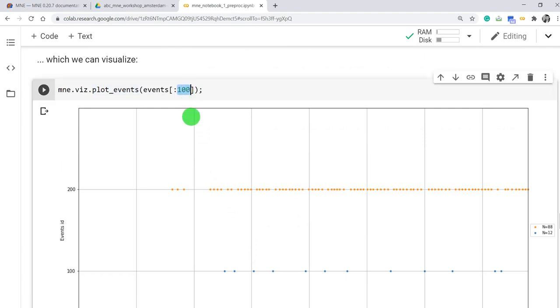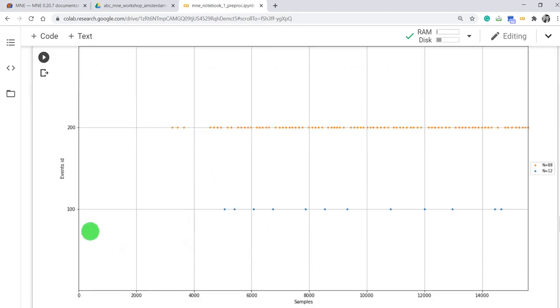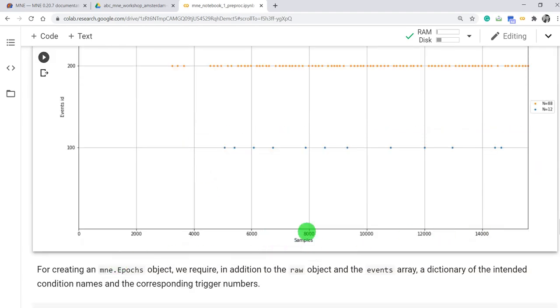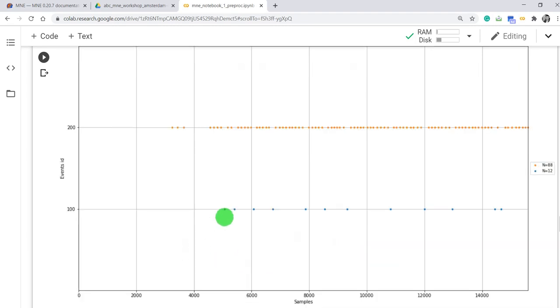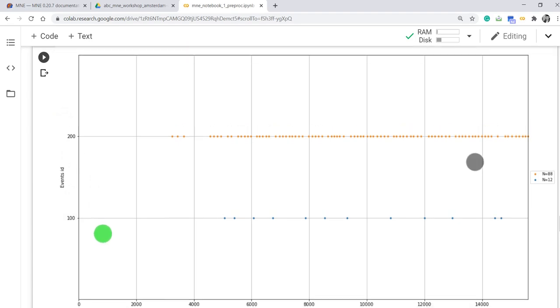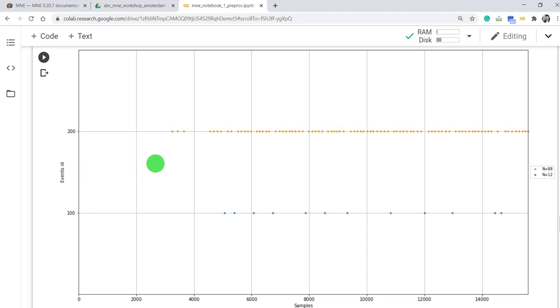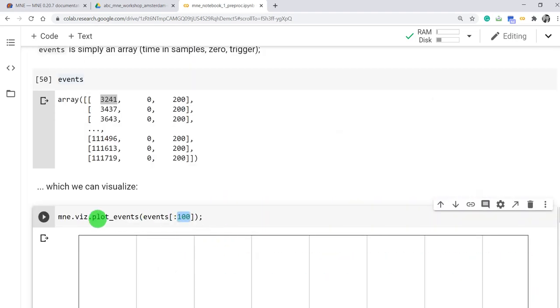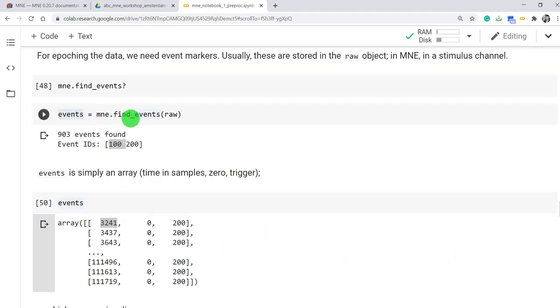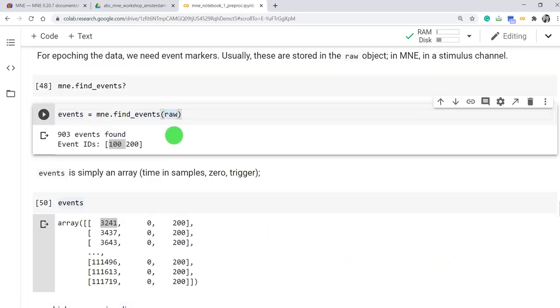We can visualize those events, the first 100 events. So here we have time axis of EEG samples and the location of time markers or events. 100, 200, those are event IDs. So now can you guess which one could be related to target ERP and non-target ERP? I said that the data loaded is ERP, event related potential. So as you can expect, the target ERP will have less number of trials as compared to non-target, with a ratio of 80 to 20 percent. So this is standard stimuli, deviant stimuli. And we use those time markers to segment our raw data into epochs.